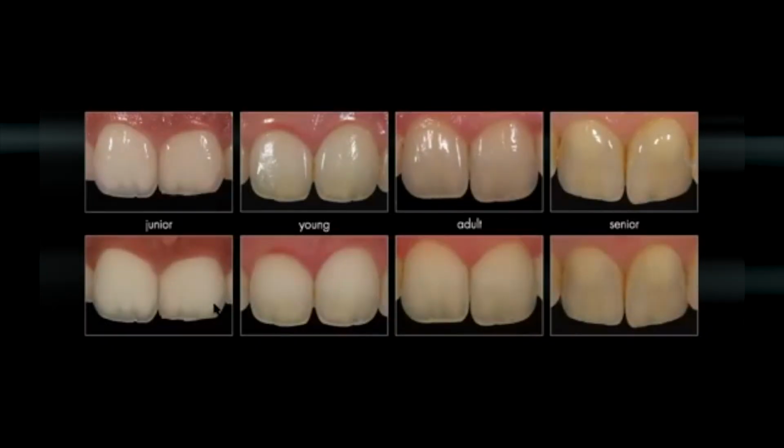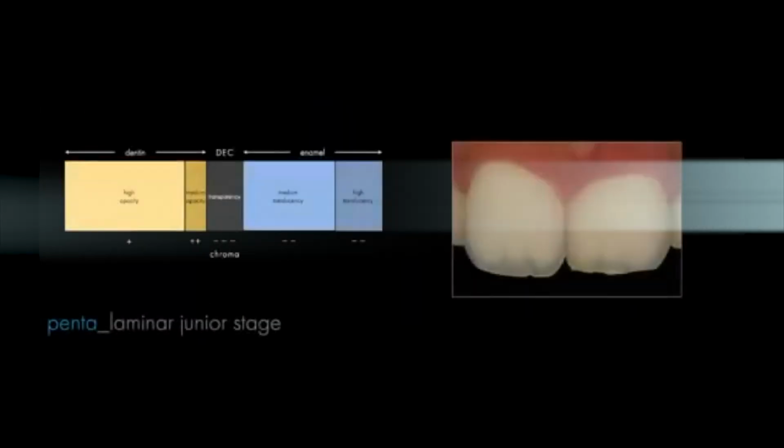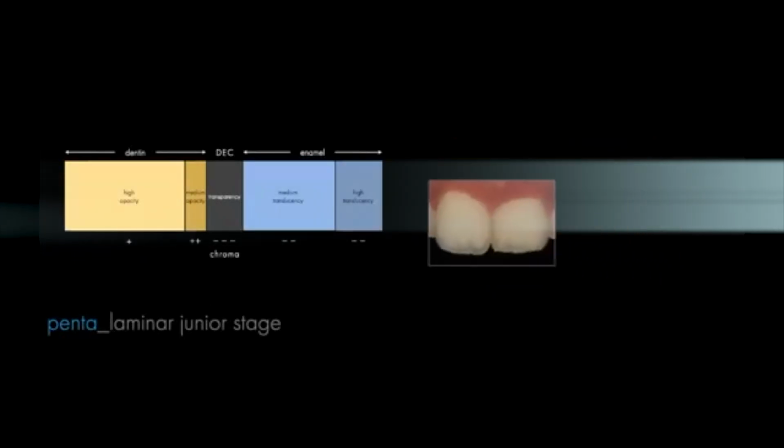So that's why we need to define these aging steps. Okay, from a junior patient to a senior patient, we need to adapt our layering in order to make it more natural. Okay, we cannot do the same layering technique for a young patient as for an older patient.